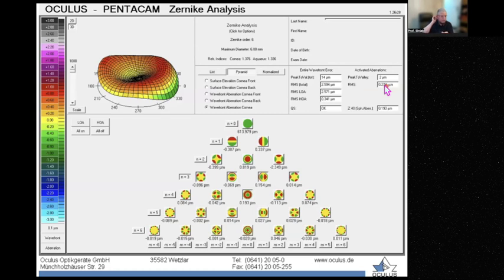Now, the EDOF lenses are more forgiving. You can use them happily when the RMS is between 0.35 and 0.5, and of course, if it is less than 0.35. So they are more forgiving. But if it is more than 0.5, it's better to avoid the EDOF. And of course, these 2 values, shift them up if you use the CSO, Cyrus, or MS39. Shift them up to be 0.5 and 0.7.